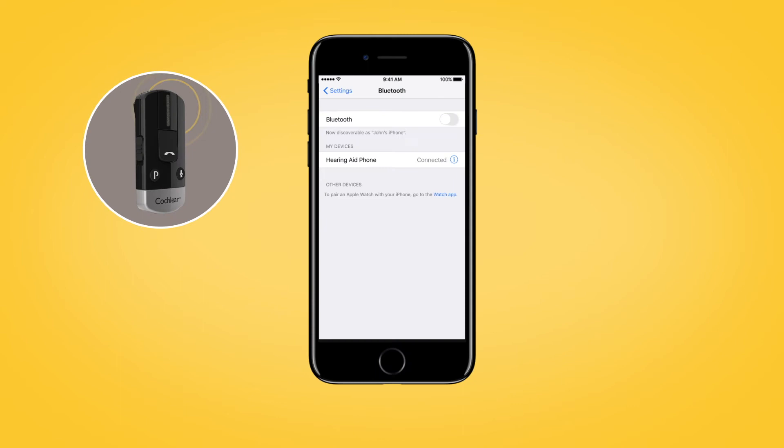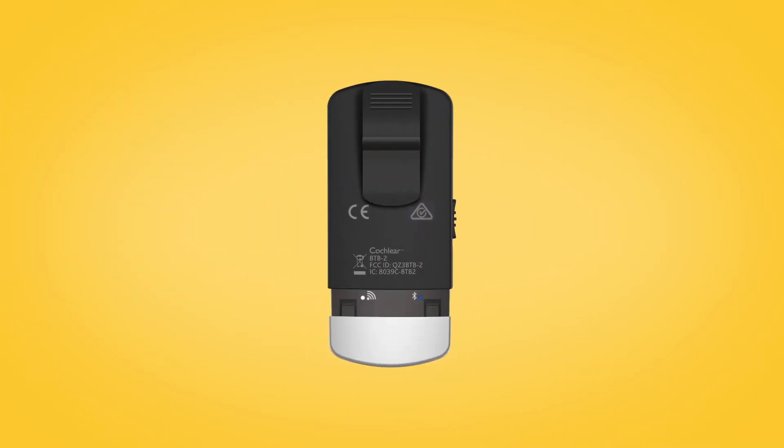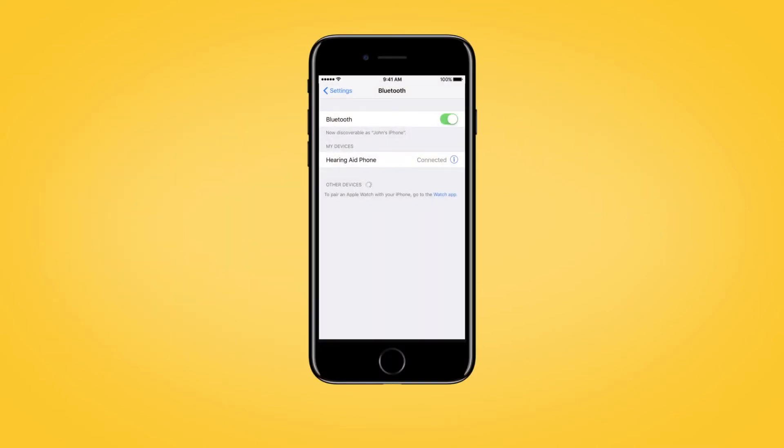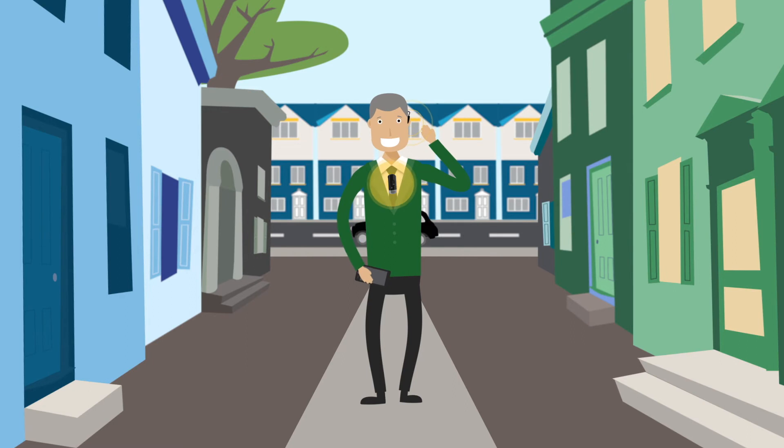To pair your phone clip to your mobile phone, make sure that your phone's Bluetooth function is switched on. Remove the silver cap and press the pairing button on the back to activate the pairing mode for two minutes. During pairing mode, the LED will turn blue. On your mobile phone, search for new Bluetooth devices and select Hearing Aid Phone from the list. If your mobile phone asks for a passcode, enter four zeros. Your phone clip should now be paired with your mobile phone.